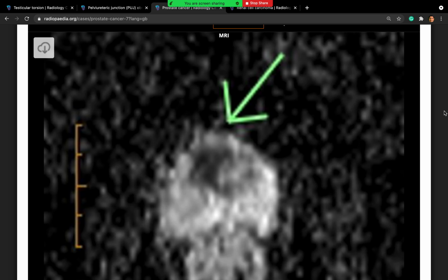And you can be a little bit faster in explaining the T1 and T2 phases. It's a very important question, but the actual question I asked you is, how will you explain the MRI scan to a patient? For example, this MRI scan could be quite claustrophobic.